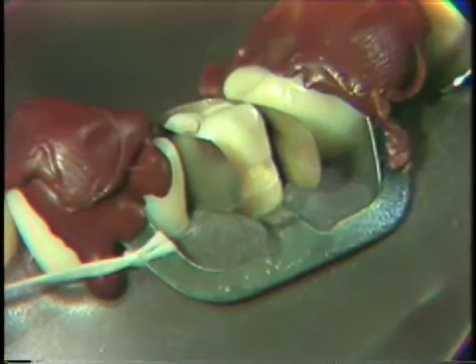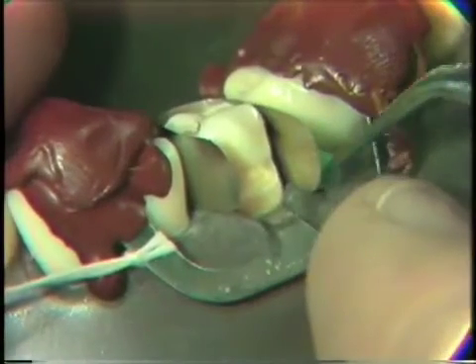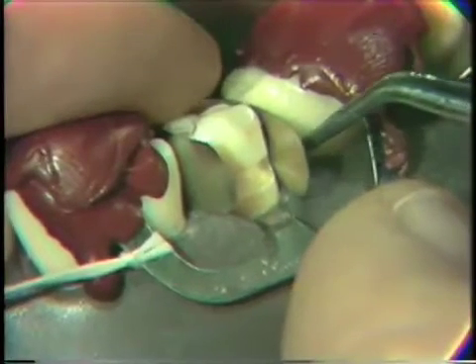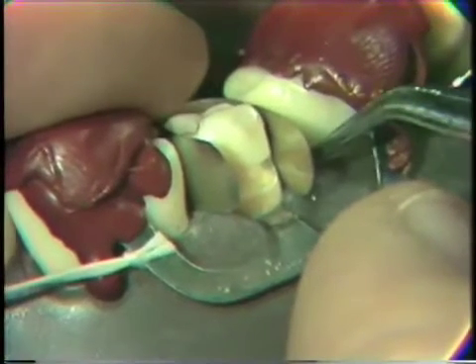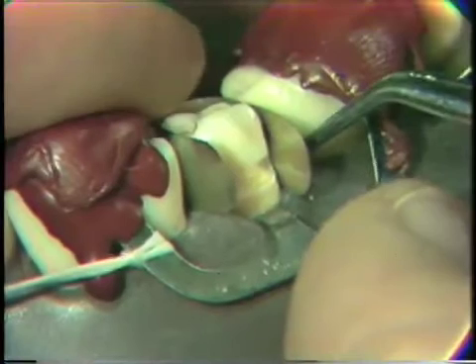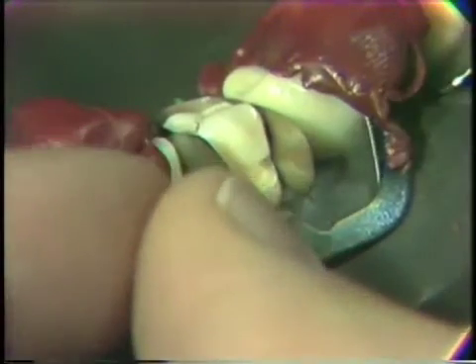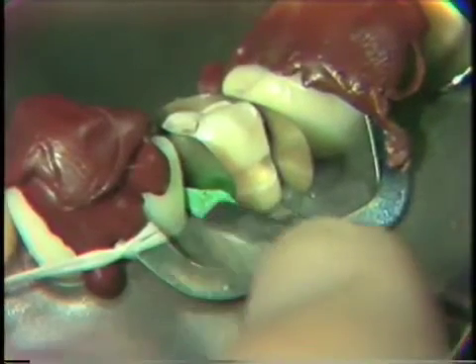We will then insert a preformed wedge between the matrix and the adjacent tooth. These wedges need to be pressed in so that they press the matrix tight against the tooth. Many times you'll have to insert them even with the buccal surface of the adjacent tooth — one wedge on the mesial, one wedge on the distal — making sure that the matrix is pressed up against the tooth.